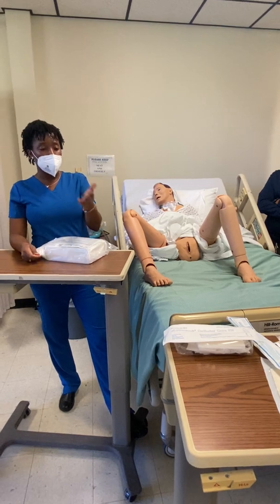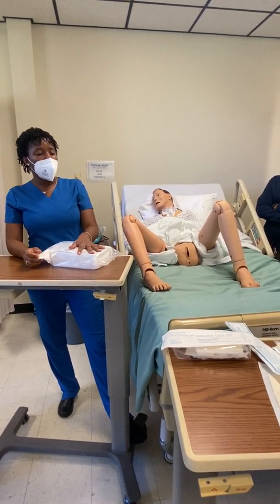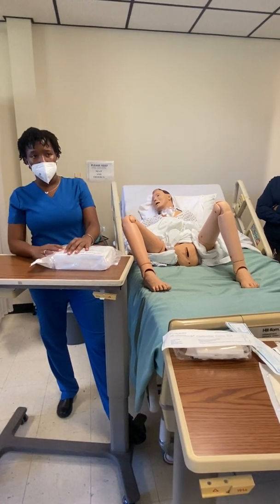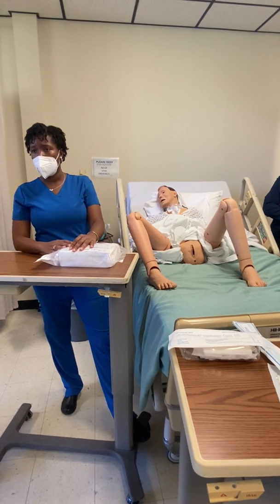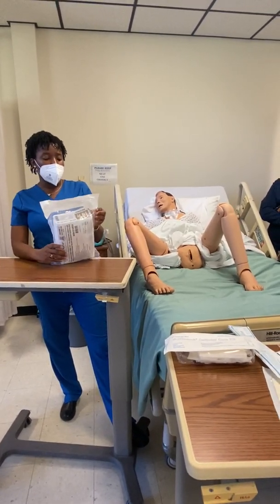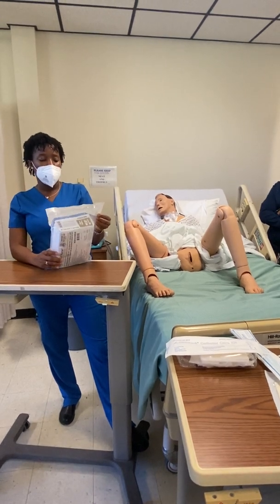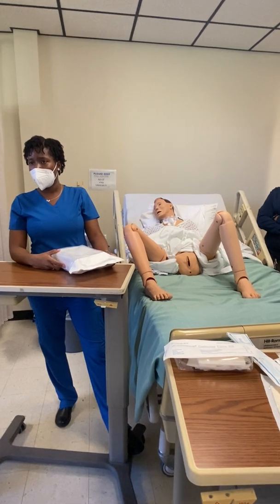If you choose to use another pair of sterile gloves versus the ones in here, that's fine. When you come in, you can just get those gloves. And you can put those on when you get to the place of putting your sterile gloves on. Okay, however you choose to do it. Now, the thing I see students get apprehensive about is they walk in and they can't figure out how to open this thing. And that gives them even more anxiety than they already have.